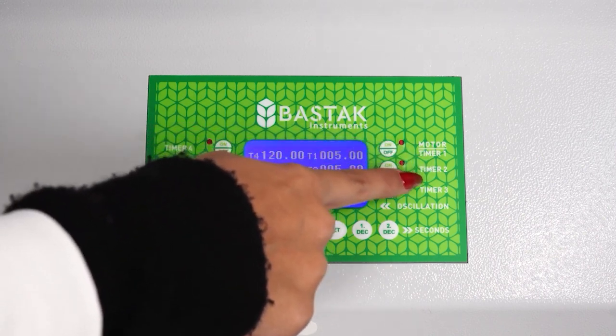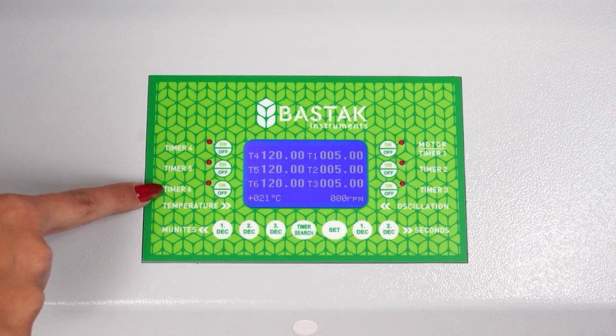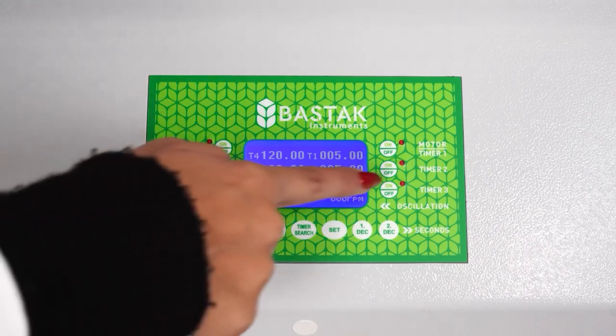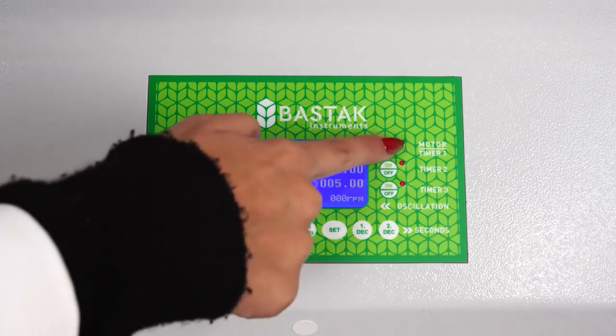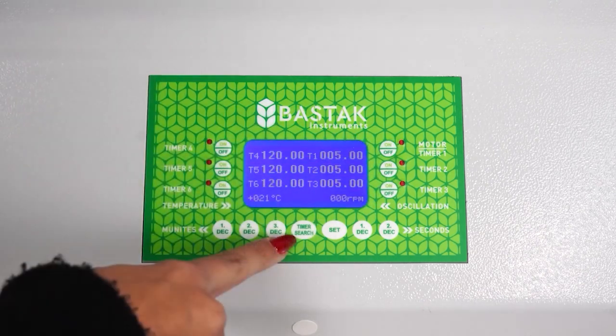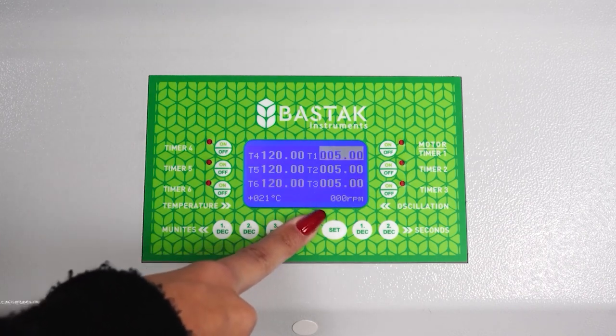Timer 2, timer 3, timer 4, timer 5, and timer 6 are 5-digit timers used for time tracking during analysis and provide an audible warning at the end of the set duration. They have LED warning lights that illuminate during operation. Timer search is used to cycle through the 6 timers on the device. Numbers are painted next to the timer it is on.